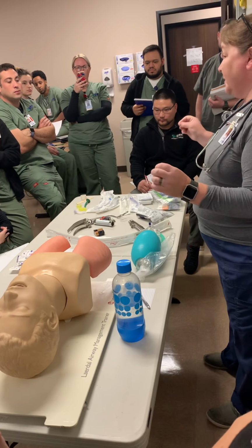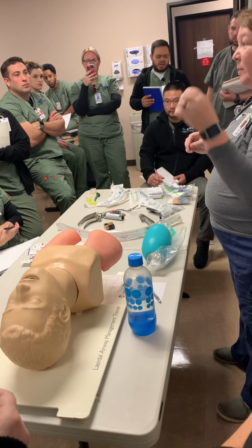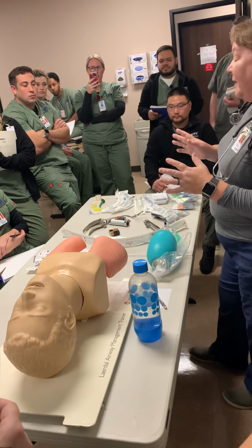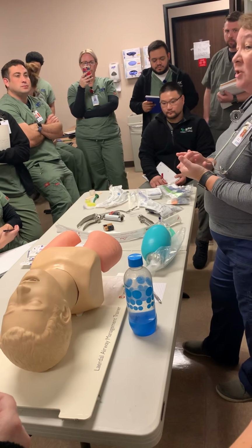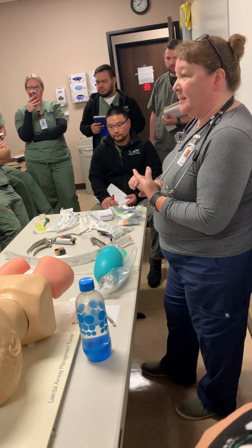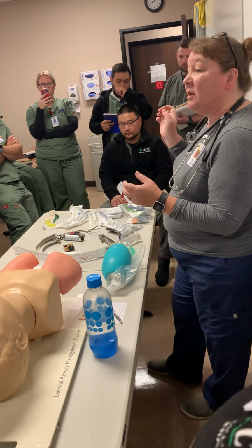We would put them on a T-piece, which is like a cool air mist with a T-piece on the end of it. I'll show you because people usually are not sure what I'm talking about until I bring it out. But we'll talk about that later. Those patients are intubated solely to protect their airway, like a burn patient, a patient with a tumor, upper airway obstruction, things like that. In those instances, we might just give them humidified oxygen. Again, we don't see it very much anymore.